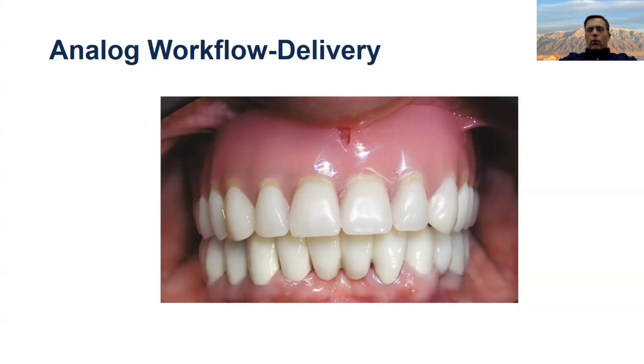So as you guys know, there are some parts of this process that can be frustrating because in some ways, every time you get an analog denture, you're kind of starting over. So you had the bite block, and so the fit will be the same at the try-in most of the time, but now you've got teeth, and the teeth can often be in a slightly different position. But even from the setup to the finish, sometimes the teeth move during processing. So you might have had a setup that was perfect, and you're like, what the heck? How come the final is different? Unfortunately, it's part of the analog process, because even when the lab is meticulous and you are as well, there are just some things that can go awry unpredictably that can lead to problems with the case.